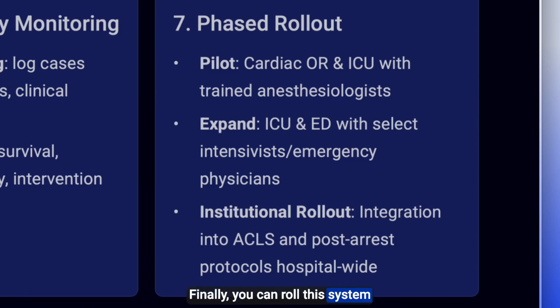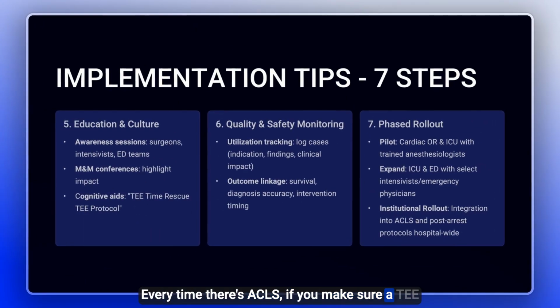Finally, you can roll this system out into the entire hospital. Every time there's ACLS, if you make sure a TEE machine, probe, and a credentialed user show up who's available to use it to help guide post-arrest management, this can be of significant benefit to your patients.